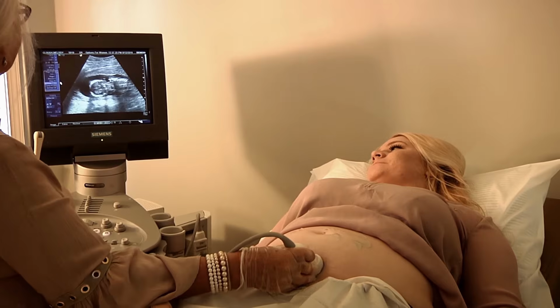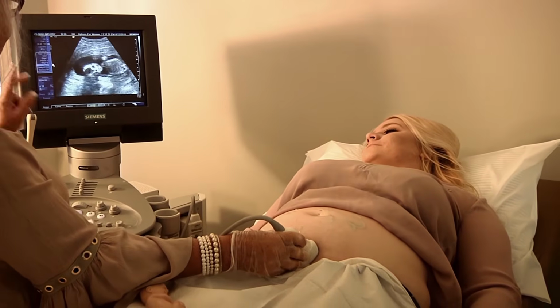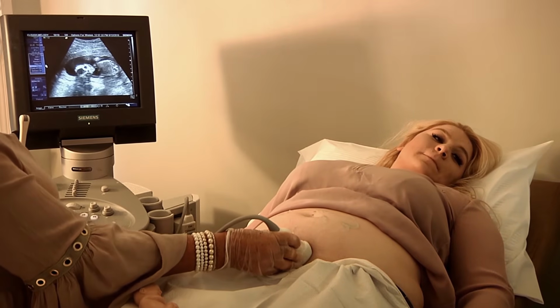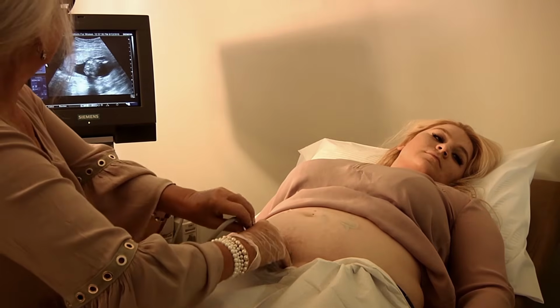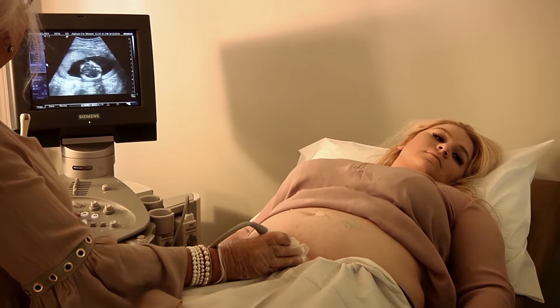And now we got the transverse. Now we see two eyes. What does that tell you when you see two eyes? Come on. BPD position. But how do we have to go? We got to turn 90 degrees to the lie of the baby. And then we go up to the head, because this is the road of our baby.